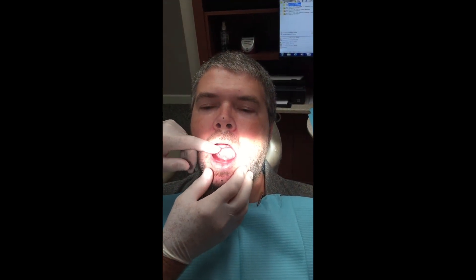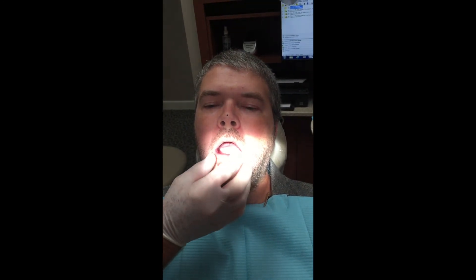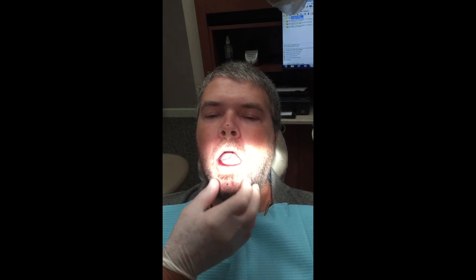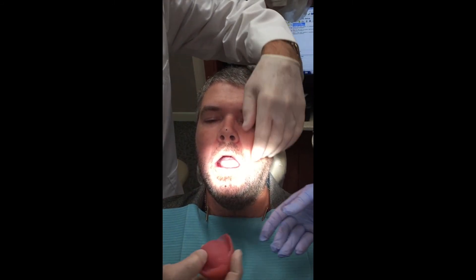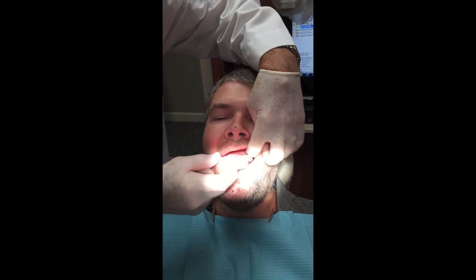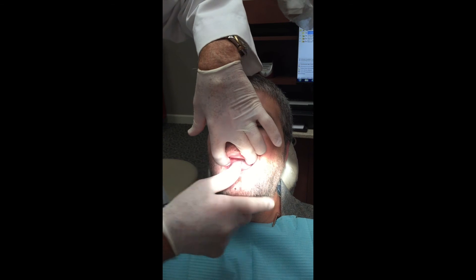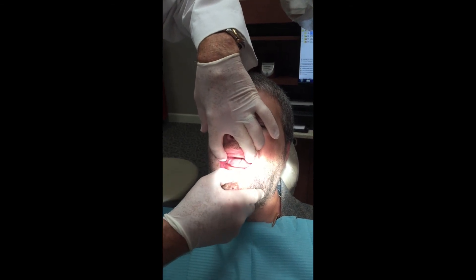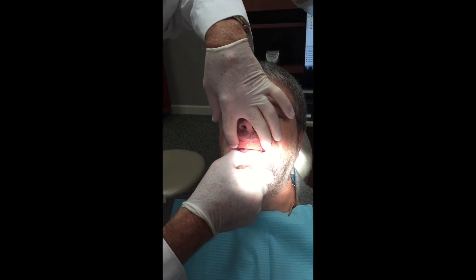One thing we're looking for is to see if it's right about where the lower incisor edges are — just about at the vermilion border. If your wax rims are too low you've got to add to it; if they're too high, you have to take away from it. Now we're going in with our upper wax rim, and I'm going to hold two hands gently together. We're touching in the posterior back there.